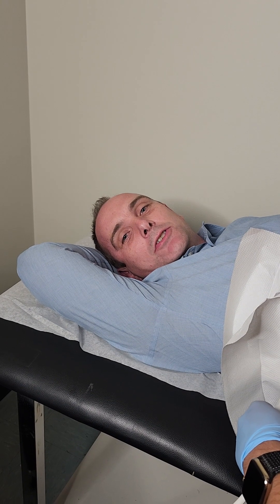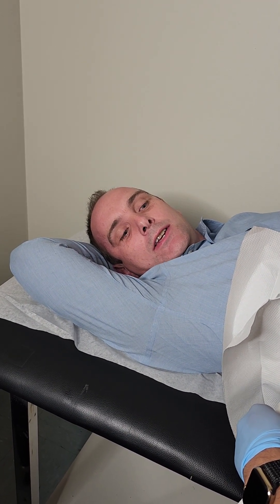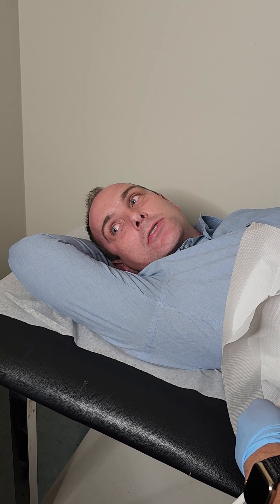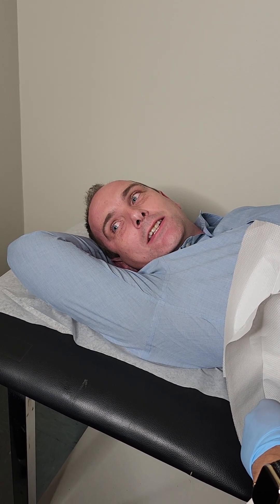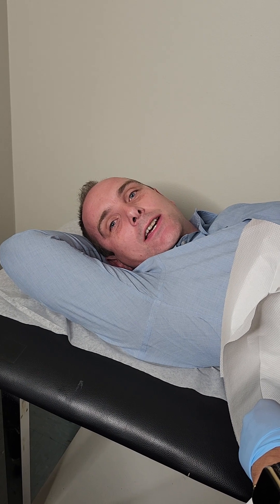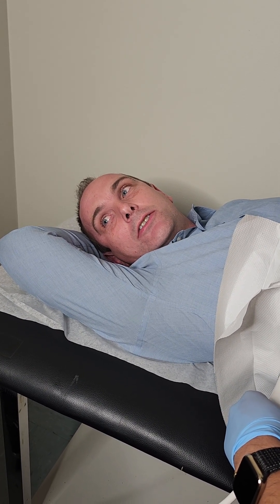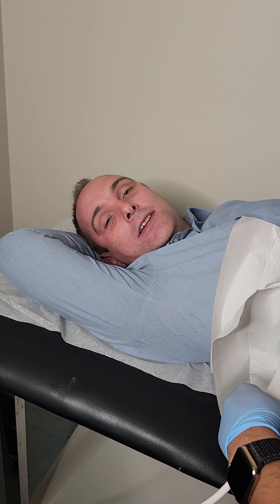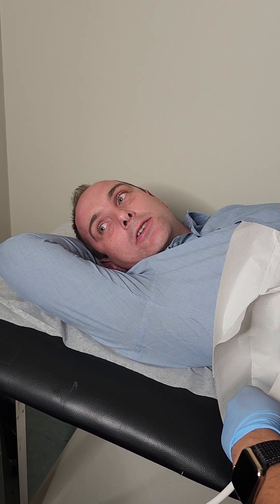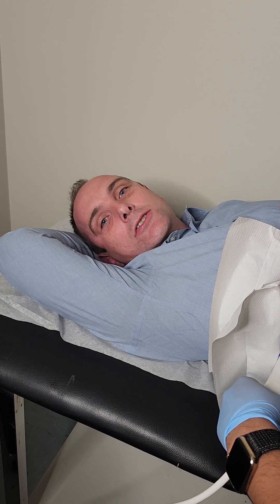Hello, I'm Dr. Brad Bryan. I'm the executive director of BioLinked. I'm here with Dr. Daniel Fox and David, who is giving me a FibroScan to check to see my liver health. I'm really excited about this and I think we should promote liver health across the communities. We're also celebrating a really important partnership between BioLinked and CRPN as well as McAllen Clinical Research.